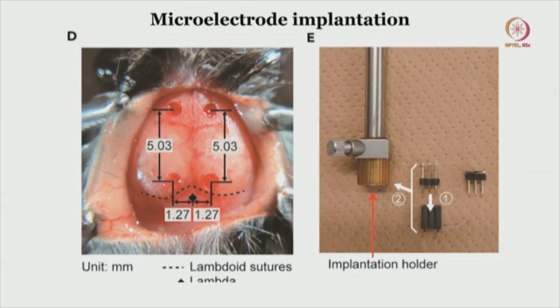So, that is the importance of mastering the basic general neurosurgical steps, and that is the whole point of having this session in the first place. These are the general basic neurosurgical steps. If one masters them, then you can do n number of various experimental methodologies on the same models.